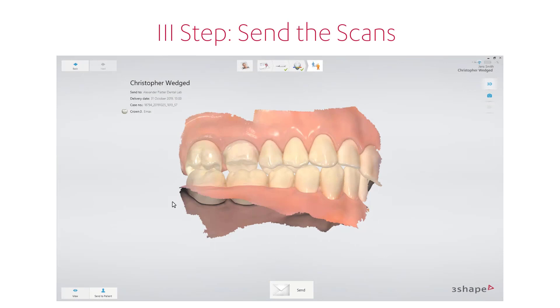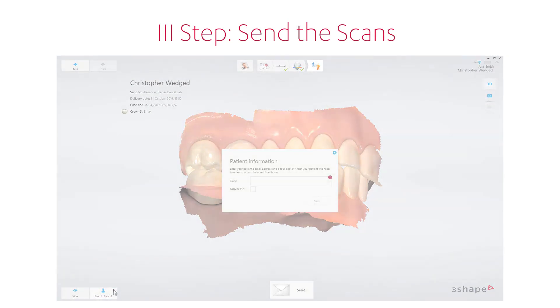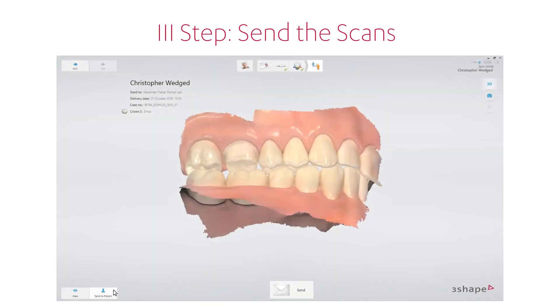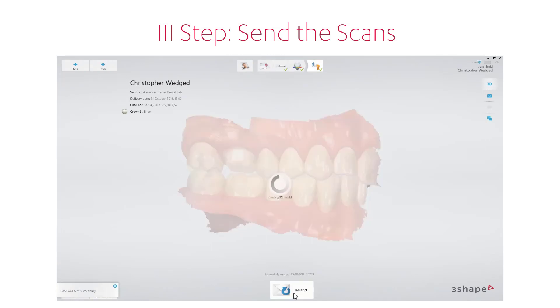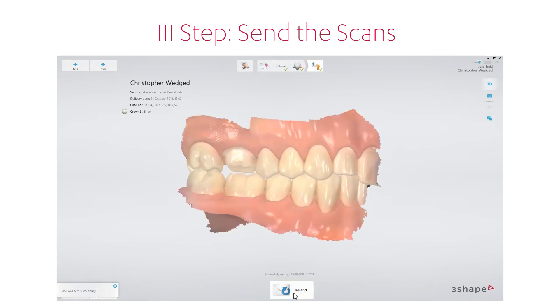The final and third step in the workflow is to send the completed order, along with any attachments or annotations, to the lab or manufacturer. It is also possible to send the scans to the patient. This means that the workflow is finished, and then the next patient can be scanned.